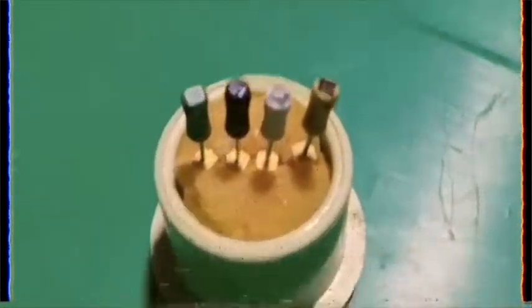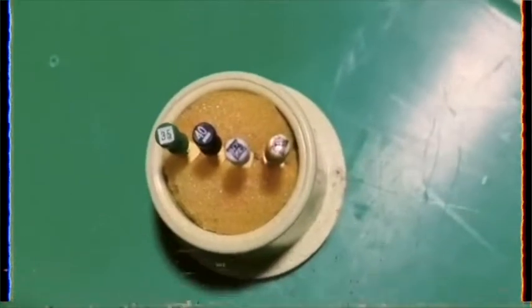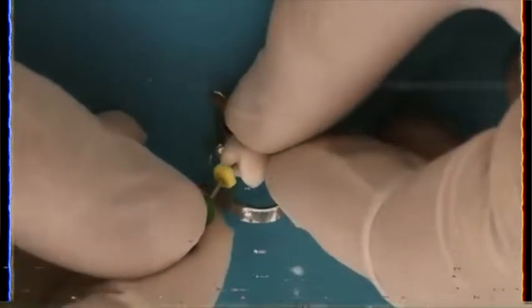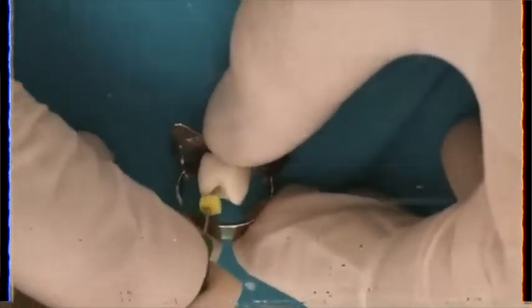Let's proceed now to the biomechanical preparation for the palatal canal, using the same set of files but at a different working length, starting with file size 35.